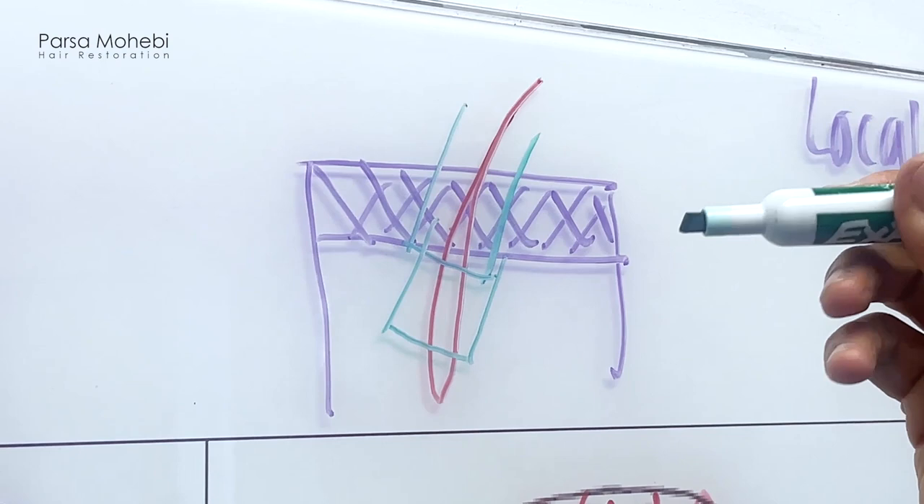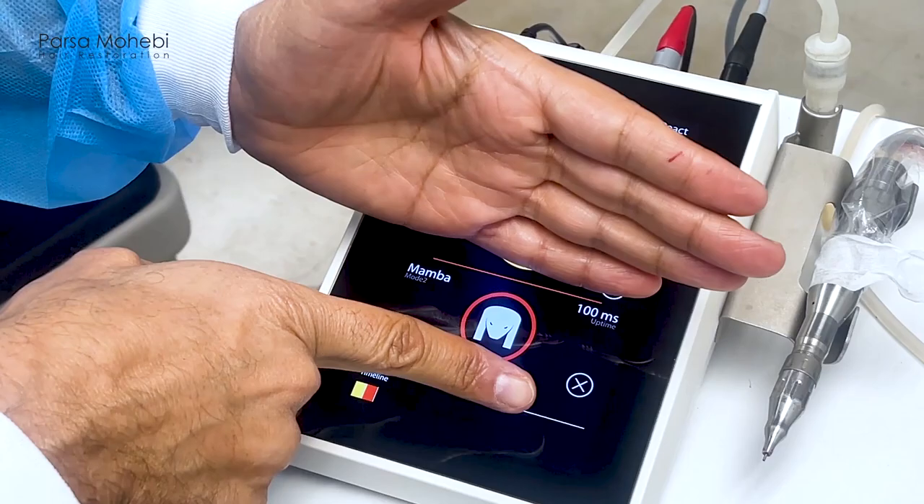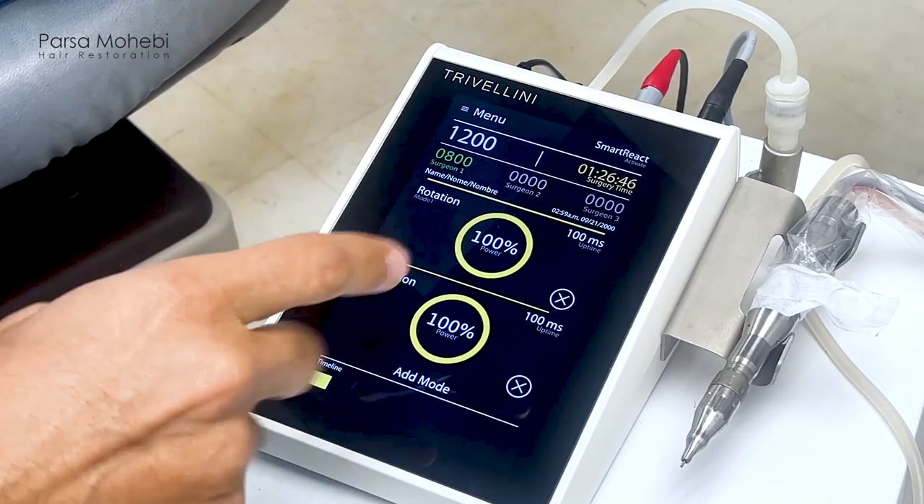The Trivelini system helps us with this. Let's focus on two phases: phase one and phase two. You can add more phases — when you start using the machine, you see there's one phase and you can add modes to it. In this case, the first mode we want to be very sharp and very powerful to cut through the superficial layers of the skin.